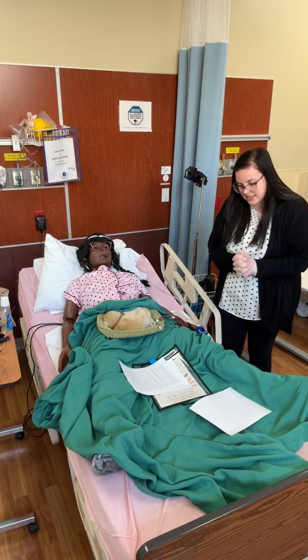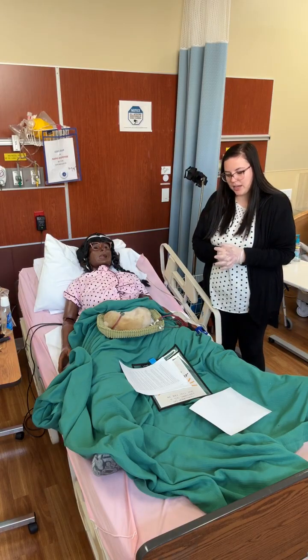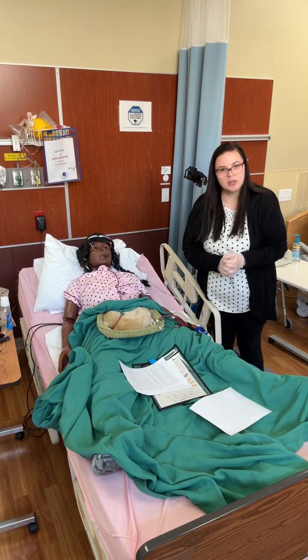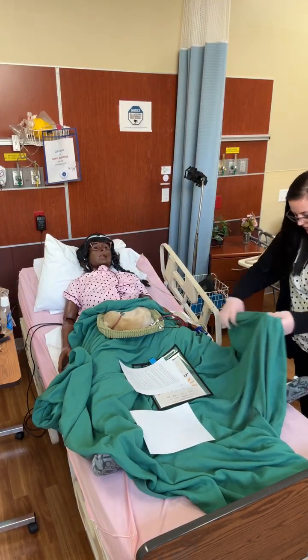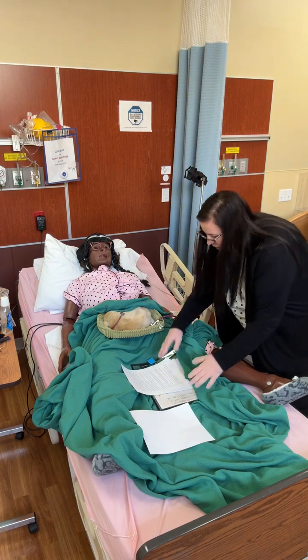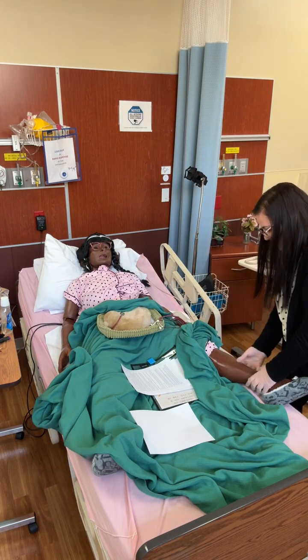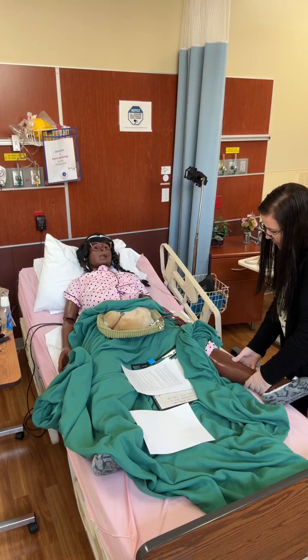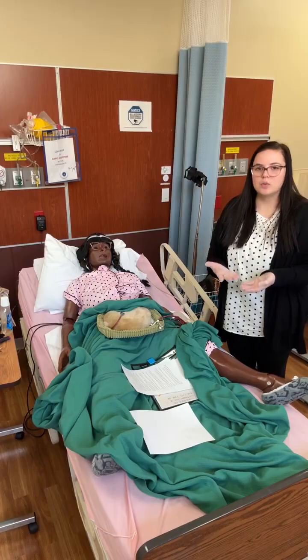If you are assessing the skin, you're going to want to provide us with an appropriate assessment question, and we will give you an answer. So an example of that, if you're looking at her legs, and you say, I'm assessing this patient's legs for edema. Do I feel any pitting edema? You do not. Okay, we do not. So go through those motions and tell us what you're looking for.